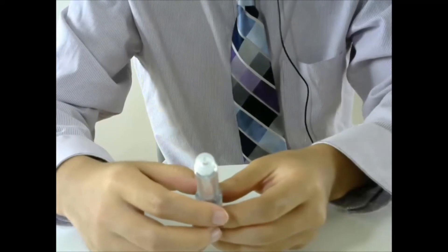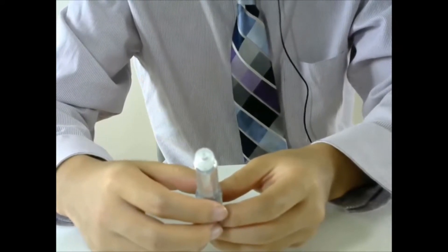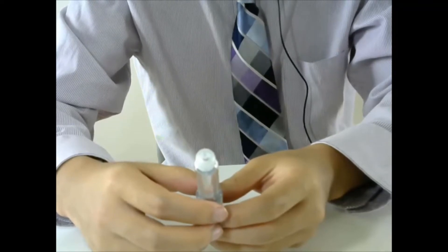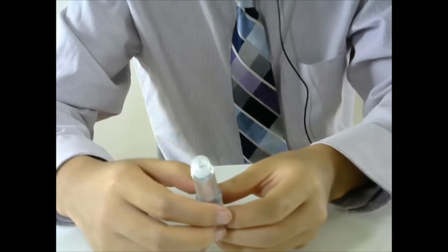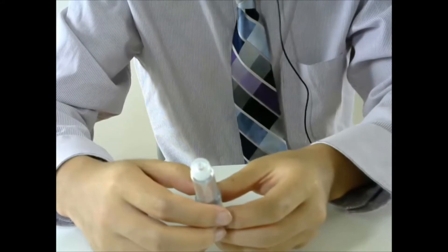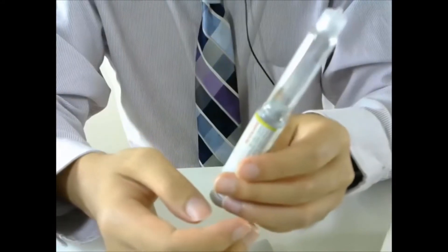The next step is to prime the pen. When I say prime, I mean to squeeze the air out of the pen so you don't inject air into your muscle. The way we prime the pen is by dialing the pen to 2 units.